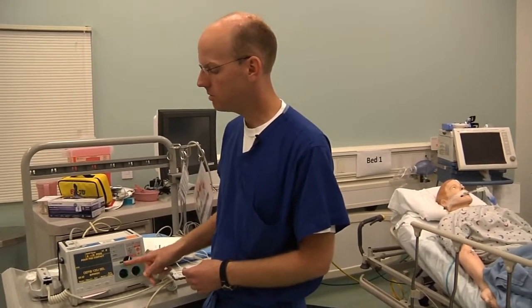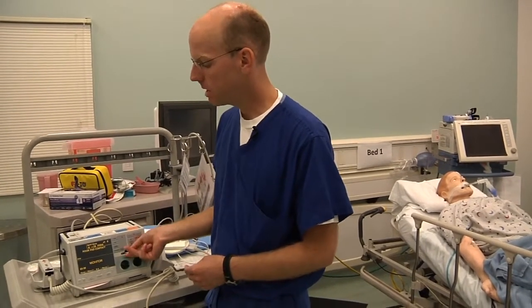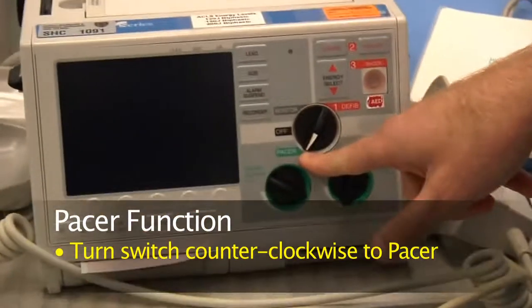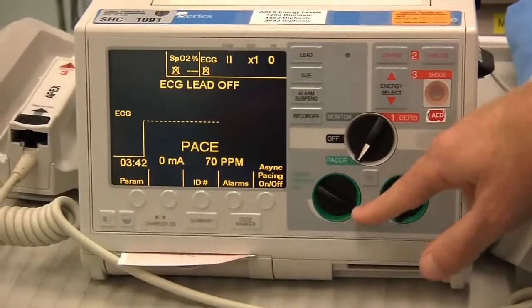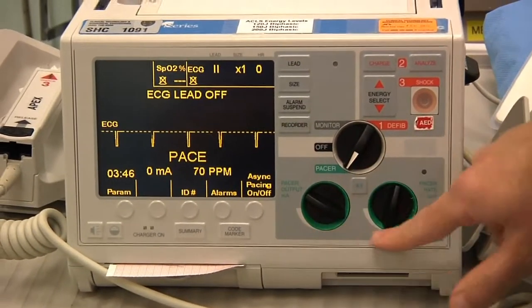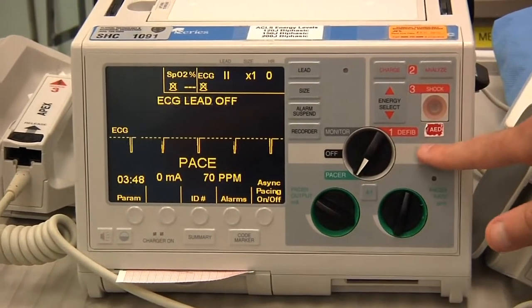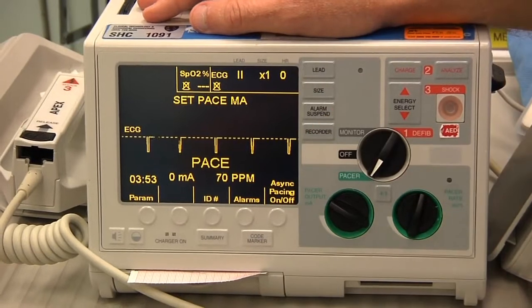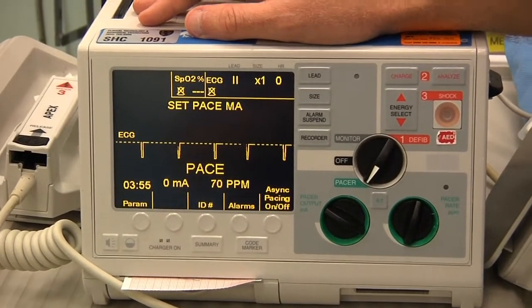Let's switch now to the pacer. So I'm going to turn counterclockwise all the way to pacer. Now that I'm on pacer, it's activating. If you notice the way they have this set, it's color schemed, right? So the green affects the green buttons, the red affects the red buttons. Now I'm on pacer. And all pacers, transcutaneous pacers, have two important switches.